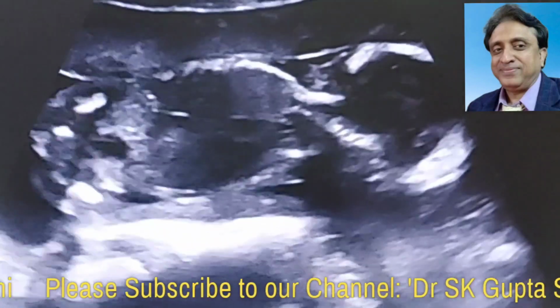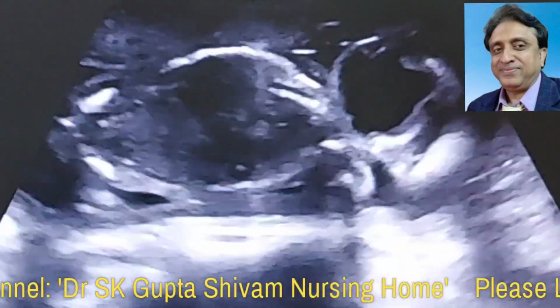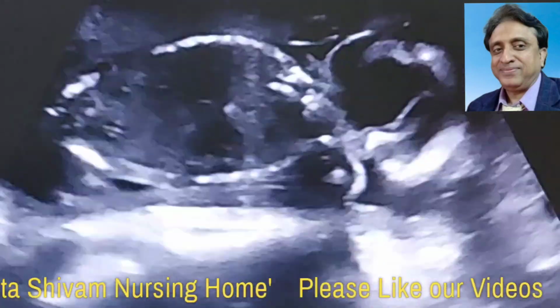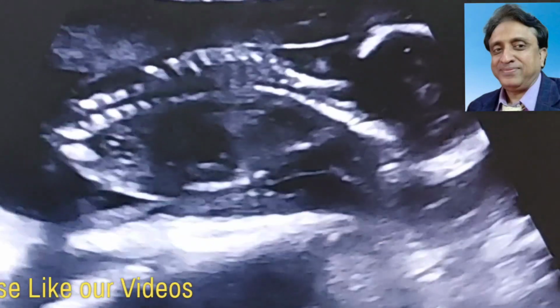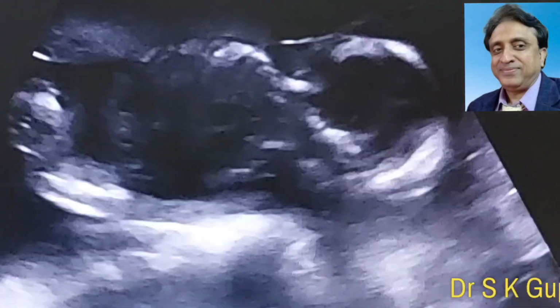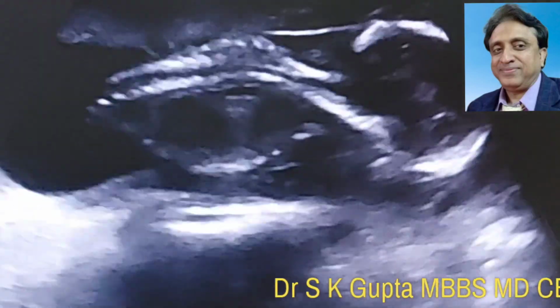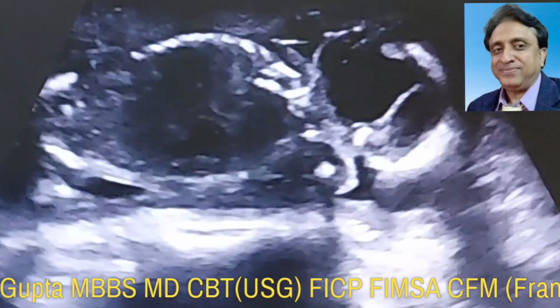The encephaloceles are not uncommon, and they are most commonly seen in the occipital region, and the incidence is around 1 in 4,000 cases, and they can be associated with the Arnold Chiari malformation or the Dandy-Walker syndrome or the Meckel-Gruber syndrome. I will not go into the details over here, but this is a reasonably good case of cerebellar encephalocele.